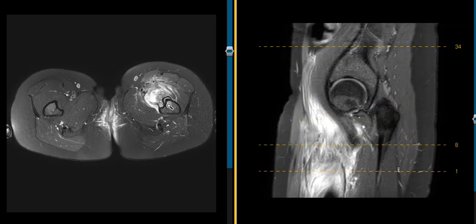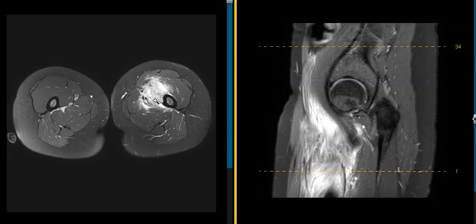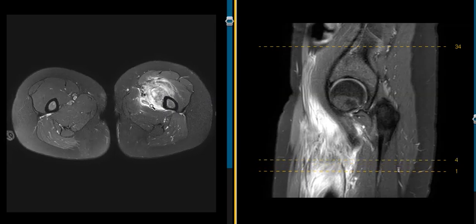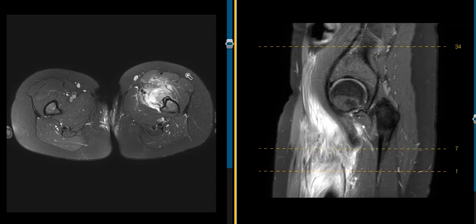A sarcoma could look exactly like this — a big heterogeneous region of abnormal signal — but she did have a history of an old injury about five years ago to this same area, significant blunt trauma, and that makes us think of something different. If there's a tear of the muscles and hemorrhage into the muscles, the hematoma can sometimes ossify or calcify, and it can cause an aggressive appearing process called myositis ossificans circumscripta.